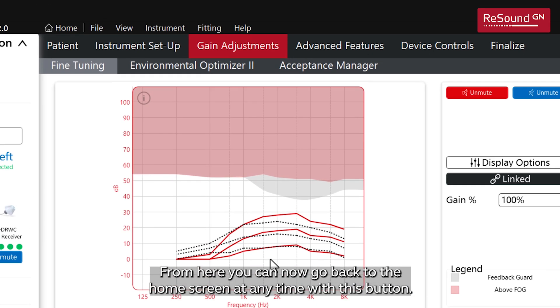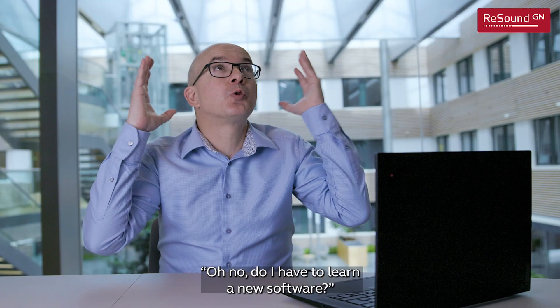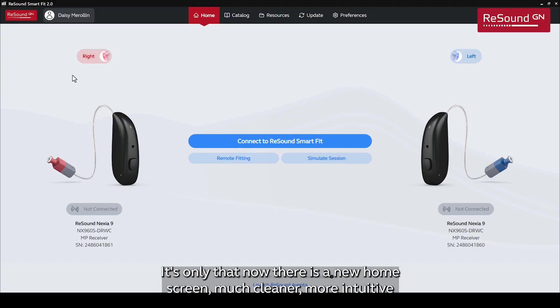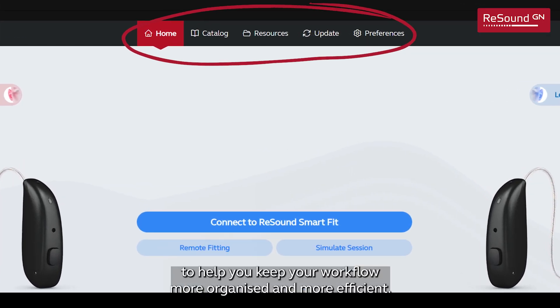From this screen, you can now go back to the home screen at any time with this button. So if you were worried about having to learn new software, the answer is no. It is the same fitting flow you already know. It's only that now there is a new home screen — much cleaner, more intuitive — and with a new menu bar on top to help you keep your workflow more organized and more efficient.